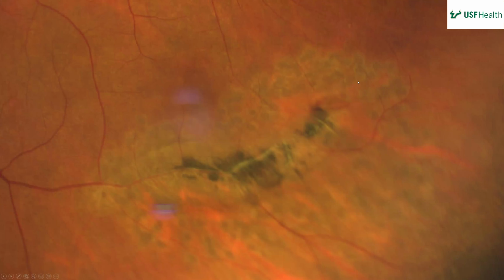You don't want to keep going, but in general, as you're laser-ing these things, you can kind of find the fluid. You can see here where there probably was a little cuff at the bottom and a little cuff around here, and that probably was a little bit of fluid at the time. So I just march my way right from the tear, laser, get a take, and then circle it, and then circle outside that and inside a little one. That usually covers it.